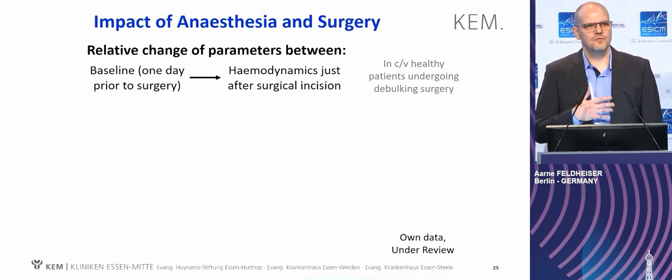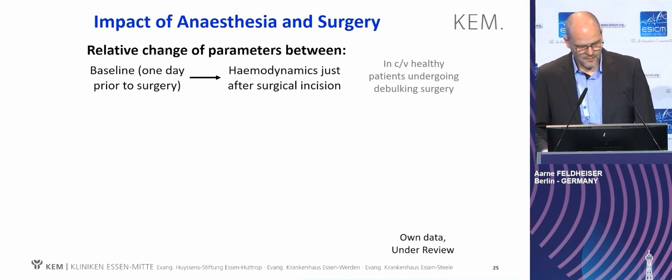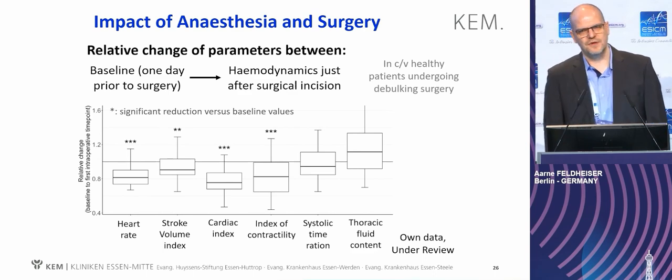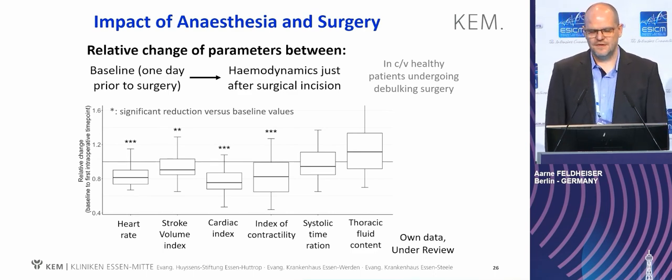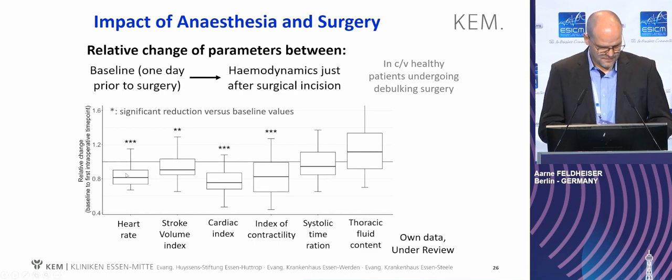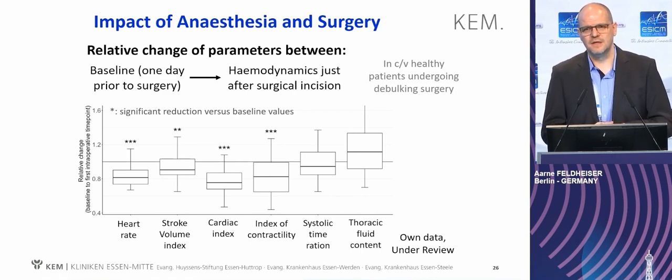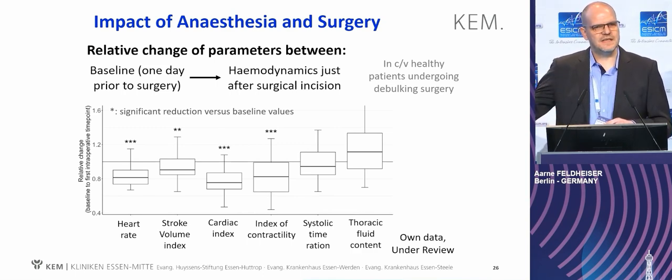Prior to the day of surgery, we measured the hemodynamic status for 20 minutes, laying down in bed. And then we compared that with the first measurements during surgery, after induction of anesthesia. And what you could see, like the study of Bernd Saugel suggested, we have a substantial decrease of heart rate, a significant decrease of stroke volume, and a significant decrease on top in the index of contractility, an inotropic marker. If we take now this first measurement as our baseline, we wrongly direct our therapy.